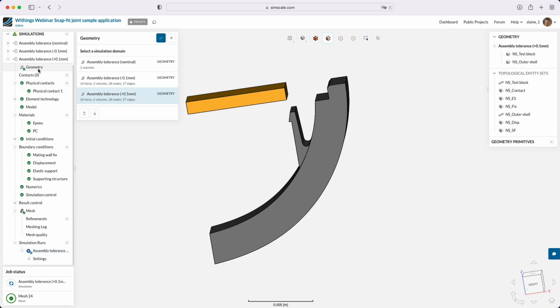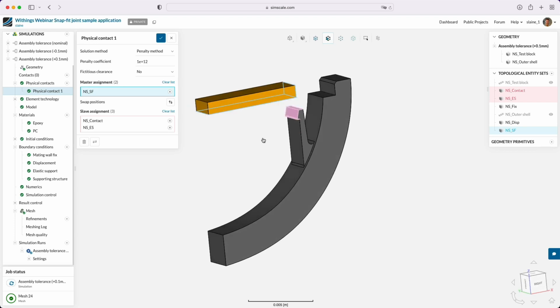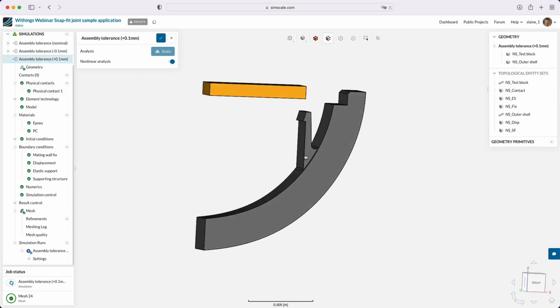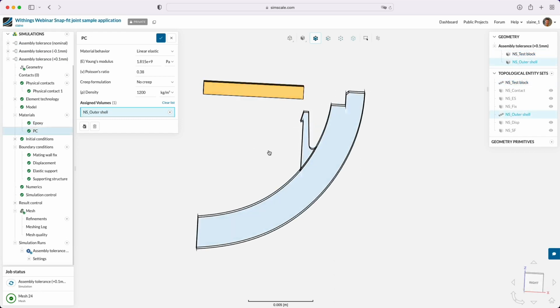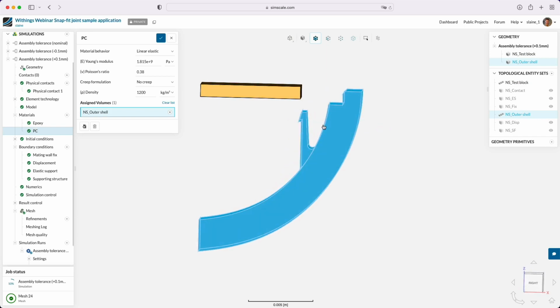Okay, so how have we actually set up this simulation? Well, let's work down through the tree. So first of all, we've got physical contacts defined between the parts that we expect to contact during the simulation, and we're using a penalty method for those physical contacts. And this is a nonlinear analysis because we've got the movement of these two parts respective to each other. For the material properties, we're using an epoxy for the base plate, a linear elastic model, and a polycarbonate for the other component. Again, linear elastic, we don't expect the stresses to go into the plastic regime of these materials.